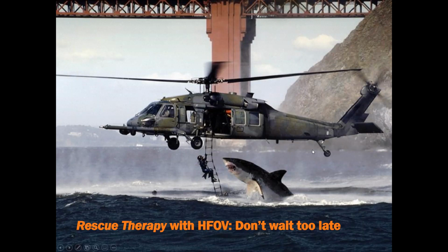So the thought is we're damaging the lungs by using high pressures with conventional ventilation. And now that the damage is done, it's kind of hard to rescue the patient with an oscillator. But if you catch it early enough, like less than 24 hours with high pressures on the conventional ventilation, and switch them earlier to the oscillator, then there are more success stories, lower mortality, better outcomes. So before the shark jumps out. Before the shark jumps out, yeah.